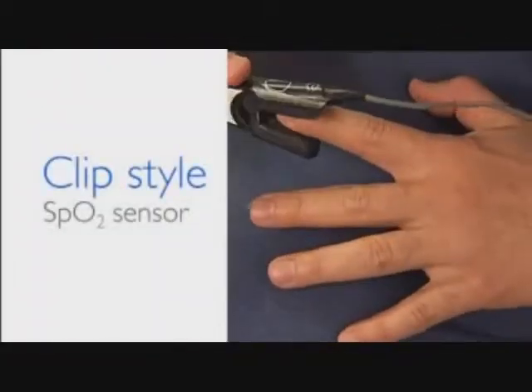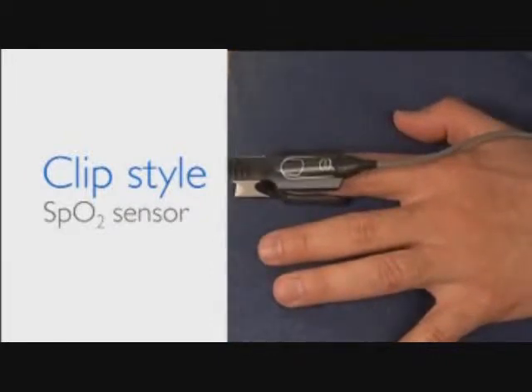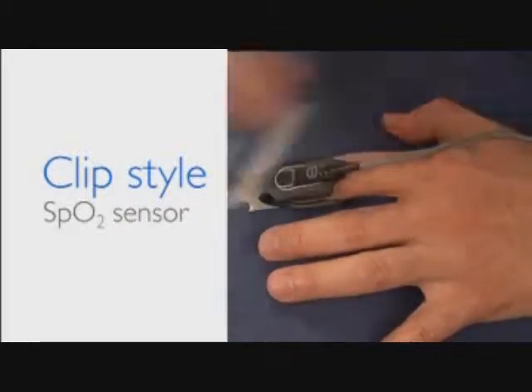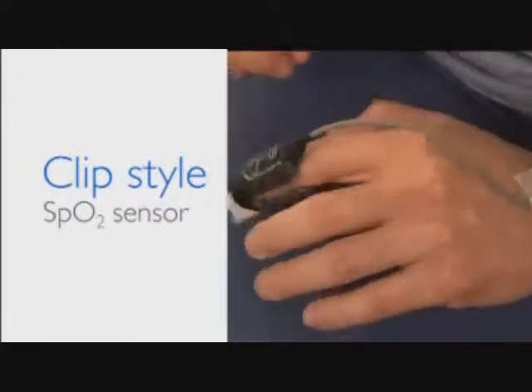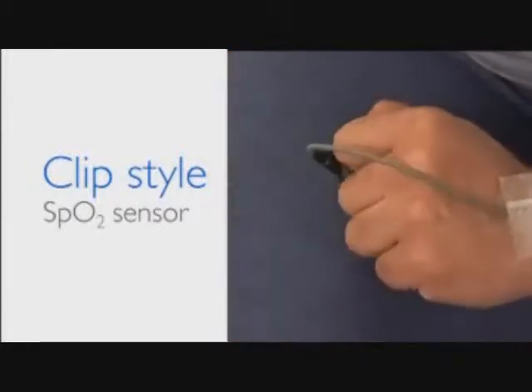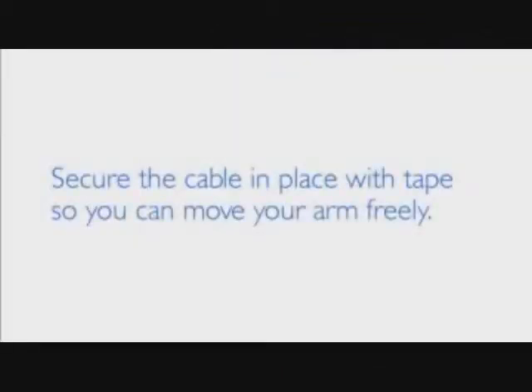If you have a clip-style SpO2 sensor, simply place your finger inside the sensor. Next, make a fist and tape the sensor cable to the back of your hand. Release your fist and place the sensor cable up your arm. Secure it in place with tape so you can move your arm freely.